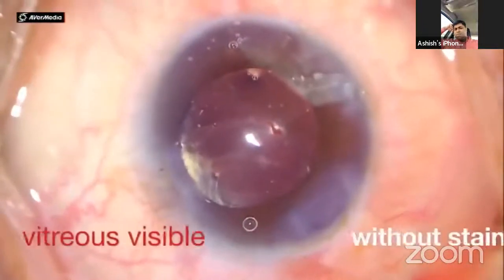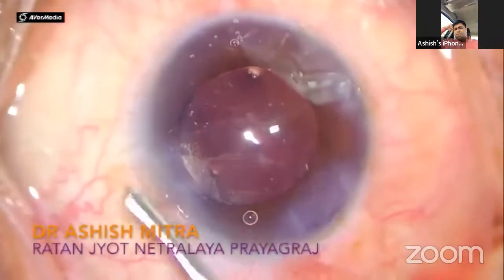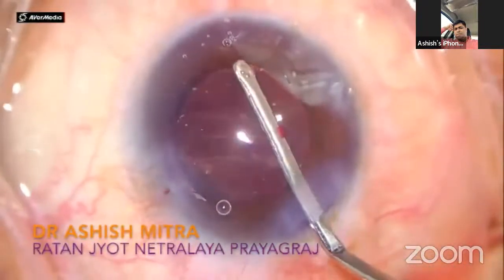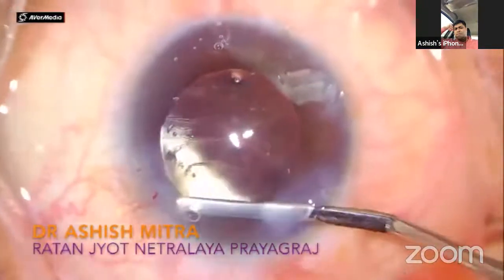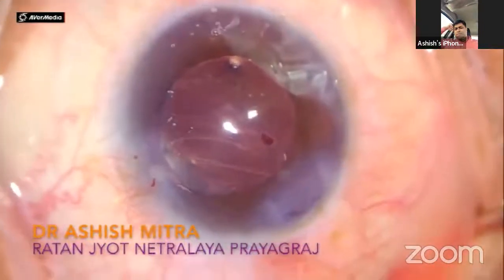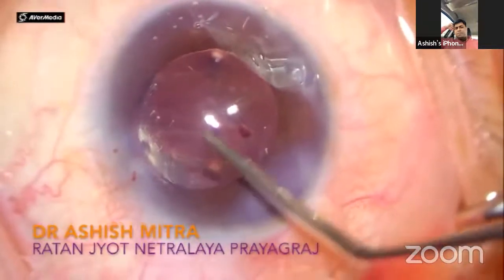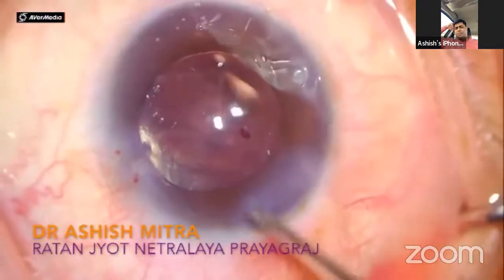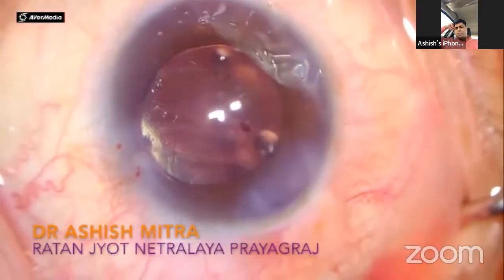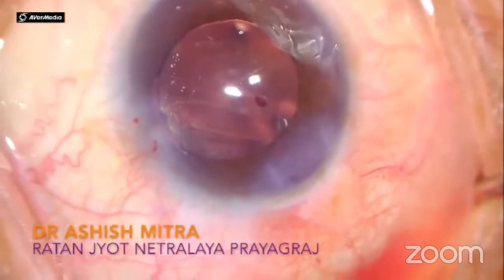Now see how beautifully those vitreous strands are seen, and that clot is now inside the anterior chamber. Now again when I am sweeping, there is a fourth strand that is coming in. Now I will count these strands which are there in the anterior chamber. See how beautifully these vitreous strands are visible even without staining with triamcinolone. 1, 2, 3 and 4. I'll count again. 1, 2, 3 and 4, and this is the blood clot which was outside, engaged and mixed with the vitreous. Now it is in the anterior chamber.